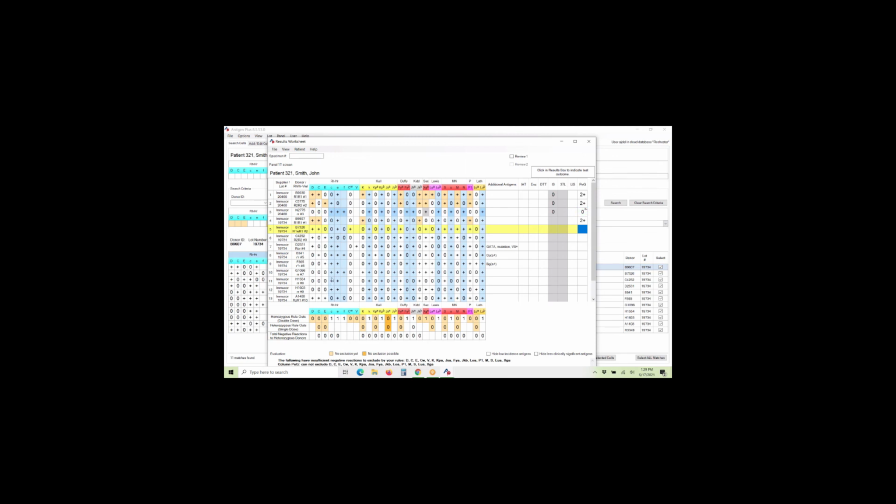In this case, all of these blue pluses, all this blue just means that it's referring to this cell. If you have that light orange color, that means there's no exclusion for it yet. Okay, so that kind of gets us started on talking about the colors.